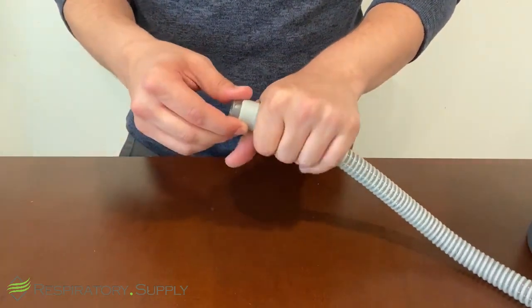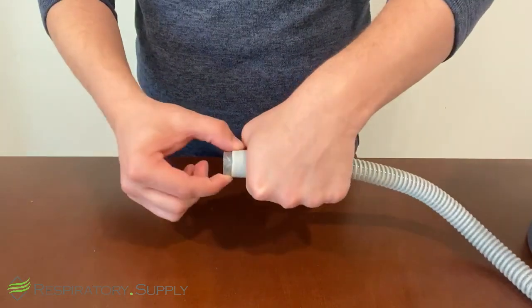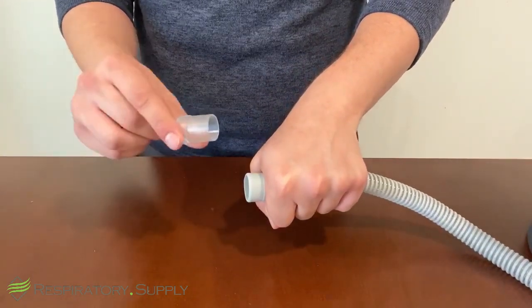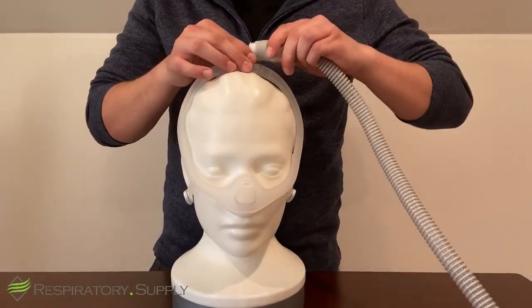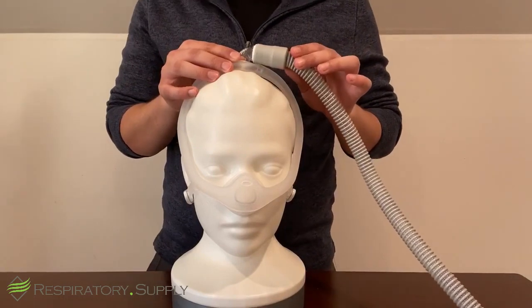Non-dominant hand, right over the rubber, not too tight. Thumb, index finger, right over it. And then, like a twig snapping motion, this will break the seal on the rubber, and you can take the connector right out. Now with the tubing connector removed, you can see here with our DreamWisp, we can go ahead and just attach it as we normally would. Nice and sealed to the new mask, and it is all set for use.